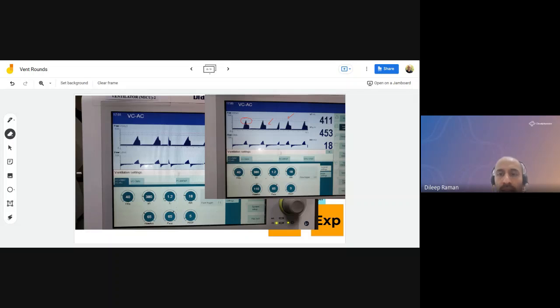And what happens is there is a little bit of a lag. So 10 to 20 ml, yes, there will be an overlap with that. And as the patient's physiology catches up, you will get an error of those 10 to 20 ml. So 380 becoming 410 is quite possible. But the 450 is because of what I was mentioning earlier. There is an expiratory flow that's happening because of trapped air that is coming out and being measured as a higher expiratory tidal volume.